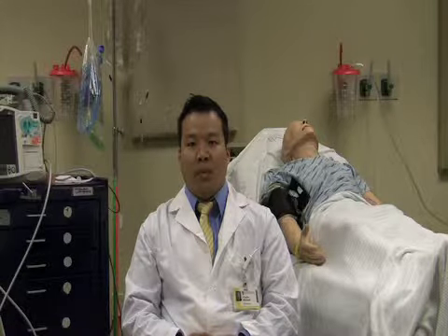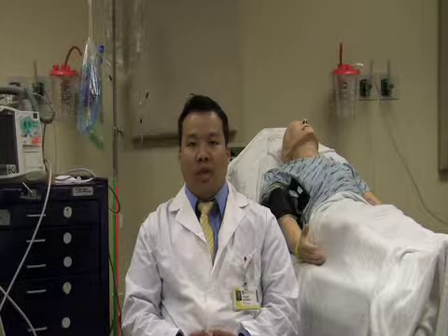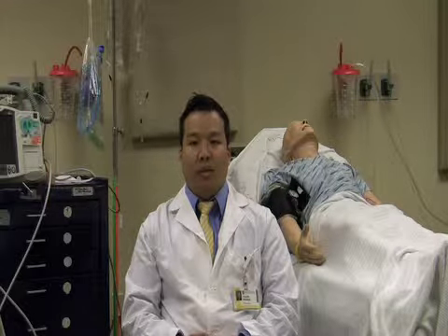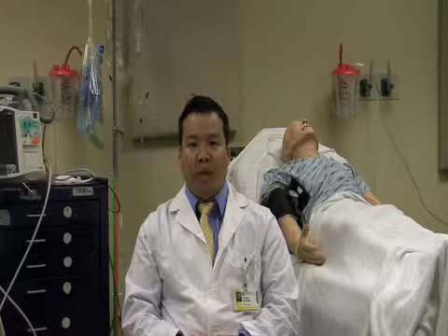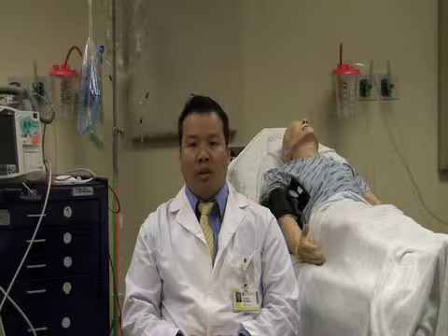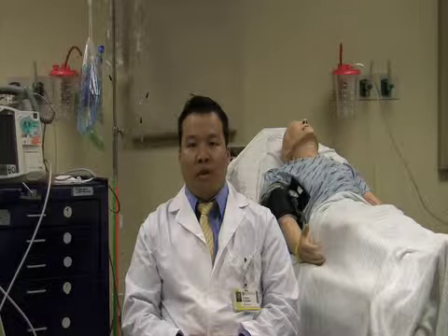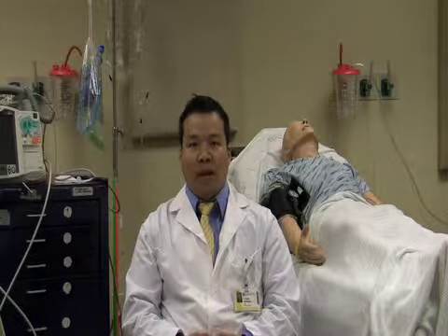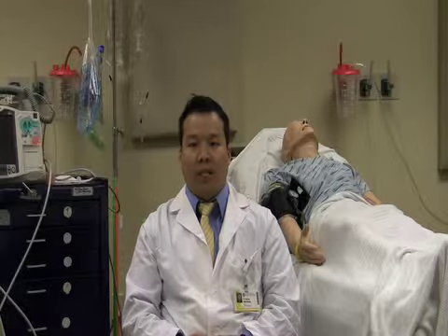Patients that present with a complaint of their pacemaker not working may present with complaints of symptomatic bradycardia. These patients should be assessed for chest pain, decreased perfusion, or other signs that are indicative of symptomatic unstable bradycardia.